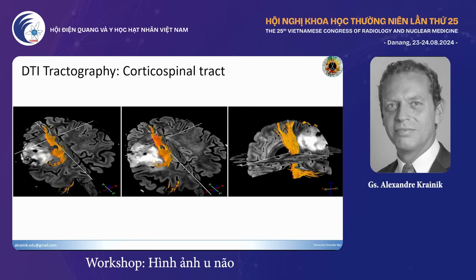Especially, you see here, the main corticospinal tract is nicely displaced inward by this infiltrating tumor. Then we see some fibers, and we feel quite confident that in this area you have fibers of the corticospinal tract. But because of the hyperintensity in T2 here, you have a loss of anisotropy. And then the software, when they go through hyperintensity on T2, they are totally lost, and they can't follow the fibers through this edema or the tumoral infiltration.